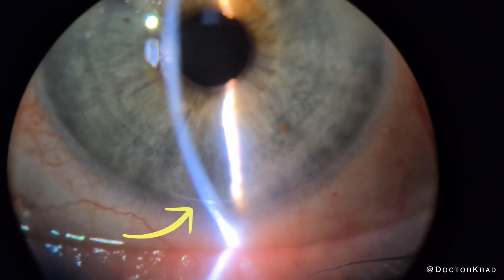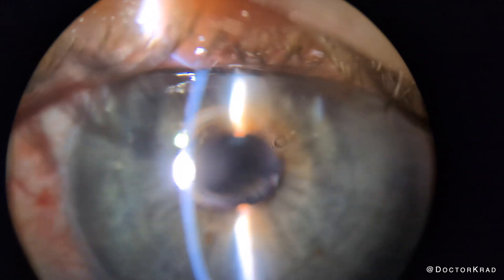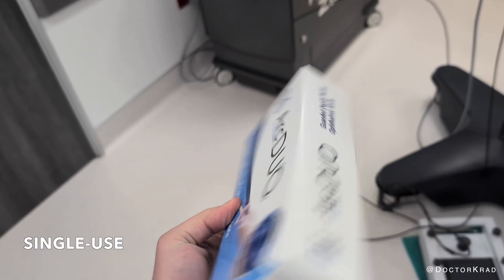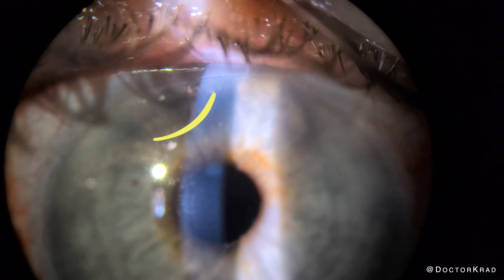Femtosecond lasers can cost over a hundred grand, sometimes a couple hundred grand. And on top of that, there are click fees each time you use it. There's no big machine you need to buy with the ARC Duo — just the cost of the single-use package, which hopefully is less than your laser click fee.